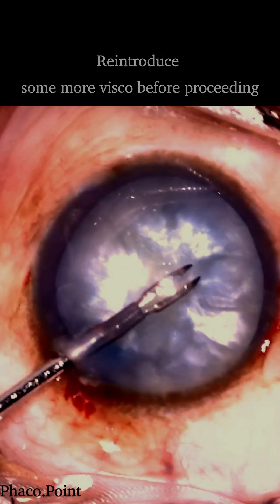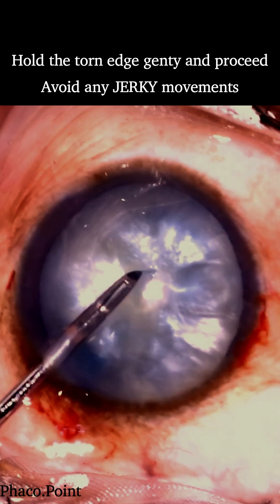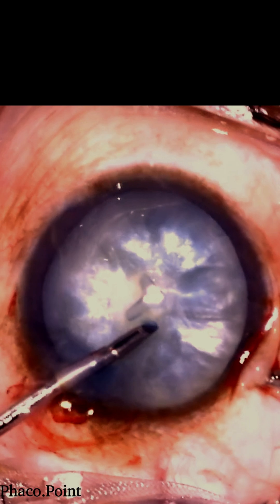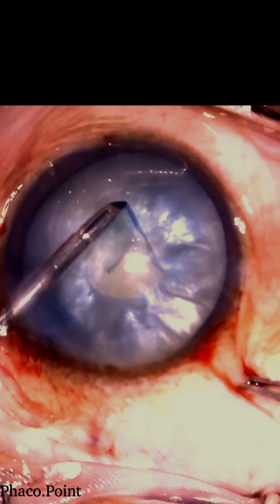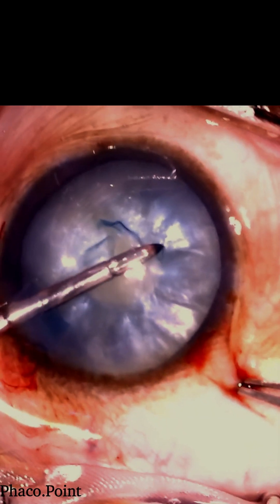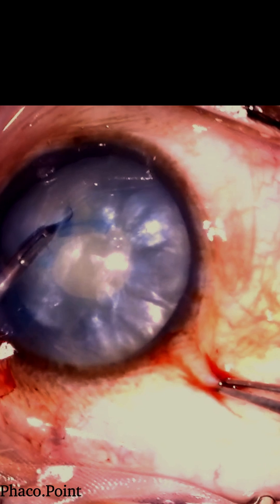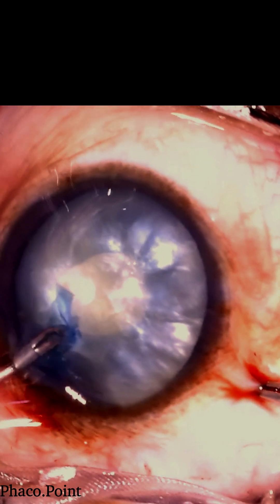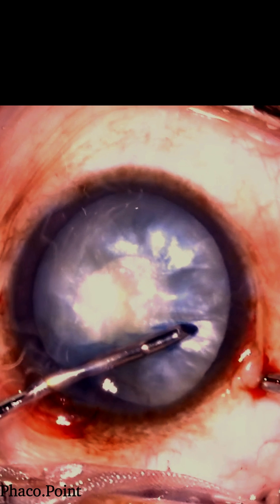Without withdrawing any fluid from within the capsular bag, an intraocular forceps now holds onto the torn edge and starts to perform the rhexis by first creating a tiny and small round incomplete circle. Whilst propagating the tear, every few clock hours the torn edge is re-grasped with the help of the forceps.